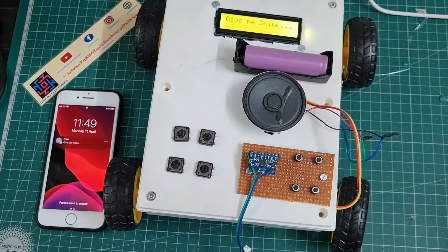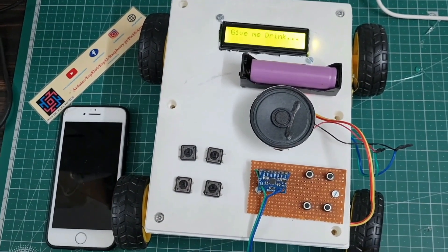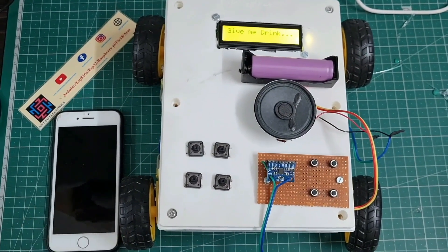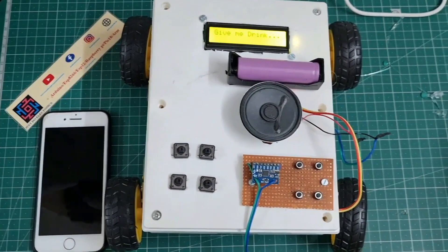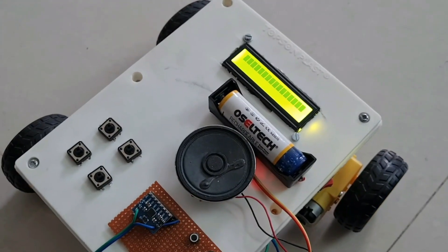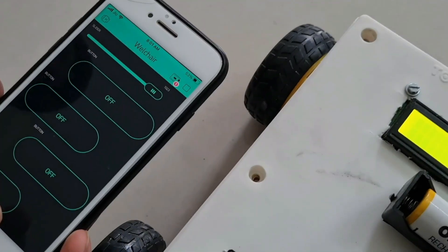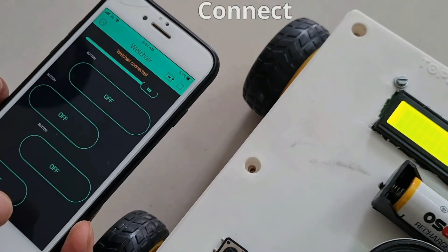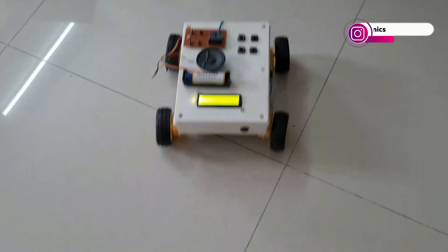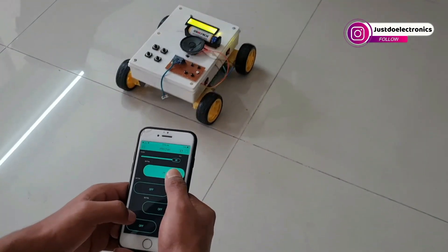Now it's time to control this wheelchair with the help of the Blynk app. I turn on the system — the welcome message will be displayed, and the Blynk app will automatically connect to this wheelchair. When I press Forward, the wheelchair goes forward. It also supports Backward, Right, and Left directions.